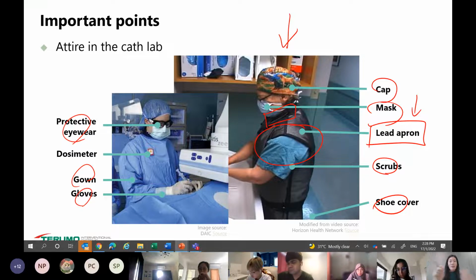Basically, even the plastic package that you have within the box is actually not sterile. Only the devices within are sterile. So typically they will have to open the plastic and drop the devices on the sterile area around the nurse, maybe on the trolley also. But definitely you don't pass the plastic or the box to these operators because they really have to maintain a very, very high level of cleanliness and sterility.